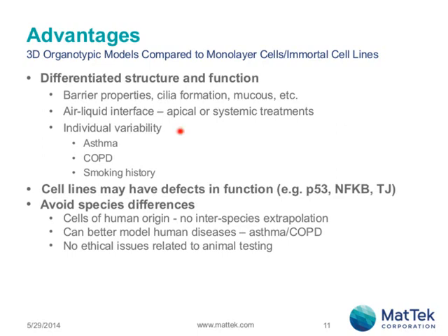Our cultures also allow the study of individual variability. In our case, we never pool the cells together. We always use cells that are obtained from individuals without ever pooling them together. We prefer this method. I know some people tend to even use pooled donors. Well, we don't do that. In addition, we have donors whose cells are isolated from asthmatic donors or individuals who have had COPD or various smoking history.